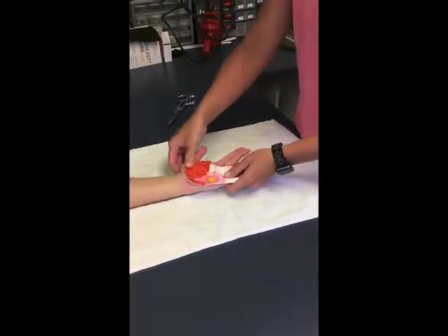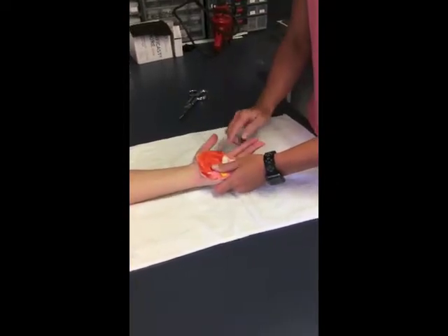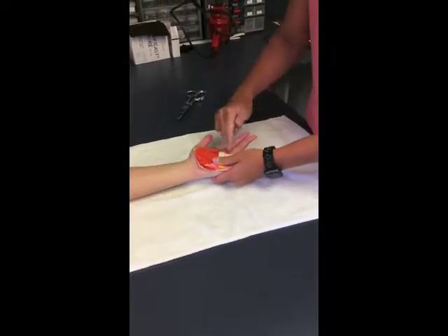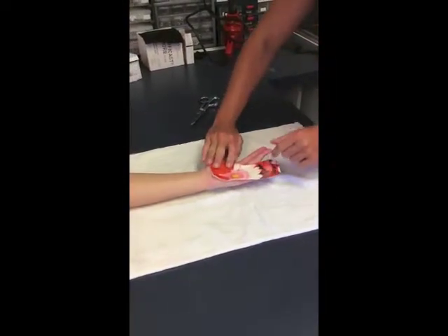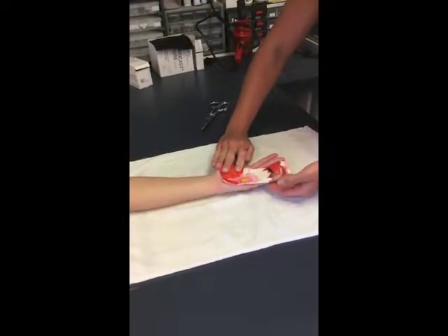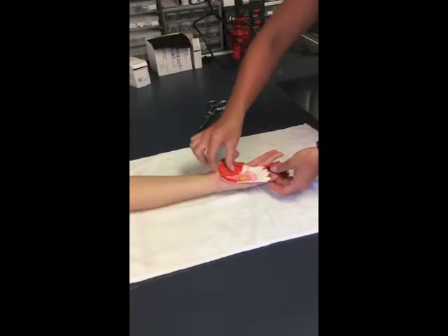Now that the splint is molded, I have to make sure that it clears her thumb, so I can cut a little bit here. Also a little bit more down near the distal palmar crease, and it also needs to clear this middle finger — it's hitting a little bit. So I'm going to cut those off and make those adjustments now.